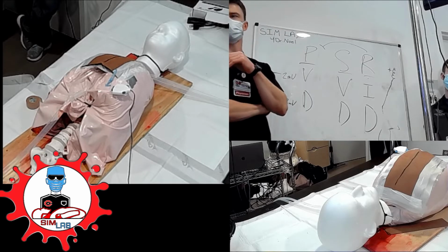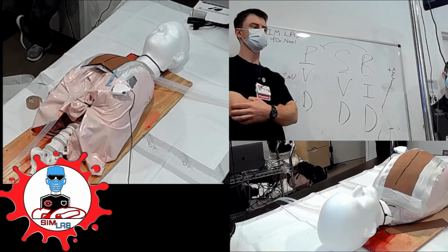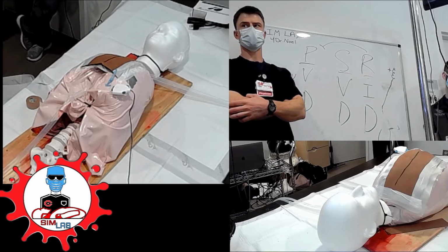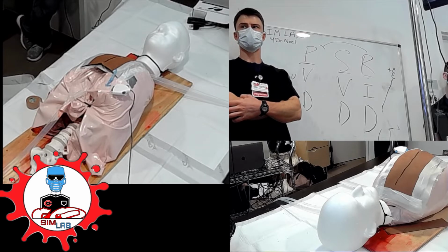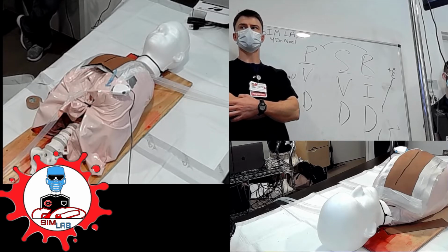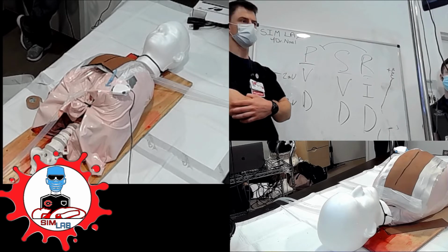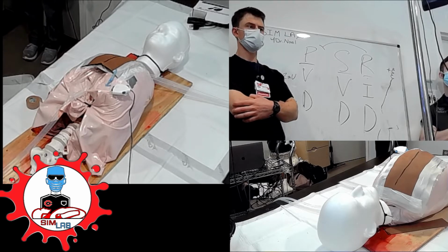Any situations where you think that would be difficult? They all have central lines in place, so floating a TVP is a non-issue. If they have a mechanical tricuspid or even a bioprosthetic tricuspid, anticipate some issues with floating. That's where you really want to get your surgeon involved, and an EP in case they have to come in and place an emergent permanent pacemaker. Mechanical tricuspids are impossible to flow through, so anticipate that being an issue. That would be the one scenario where a TVP has been tricky.